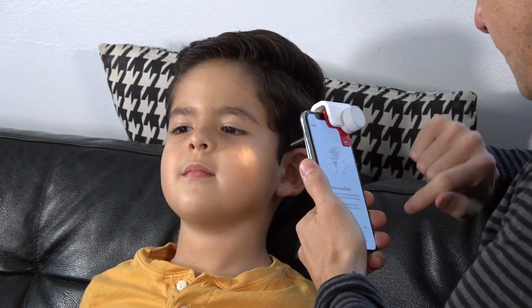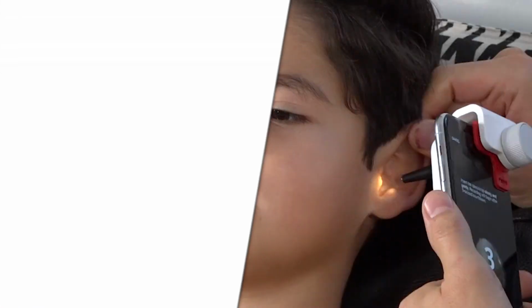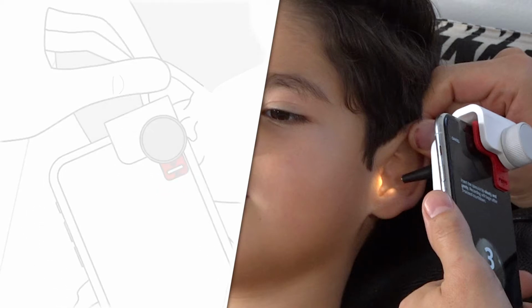The next step is important to ensure you capture a full view of the eardrum. To do that, you need to straighten your child's ear canal. Most ear canals are slightly curved. Use your free hand to firmly pull the top of the ear up and back. You need to hold the ear in this position until the recording is complete.